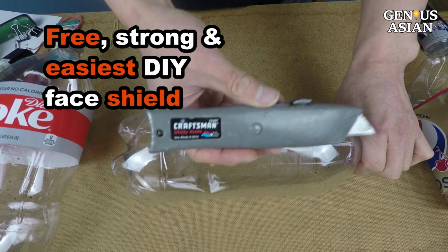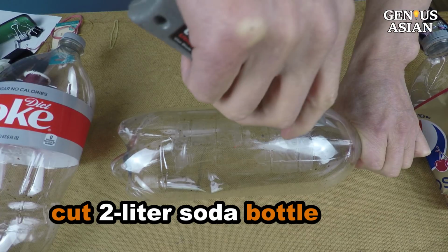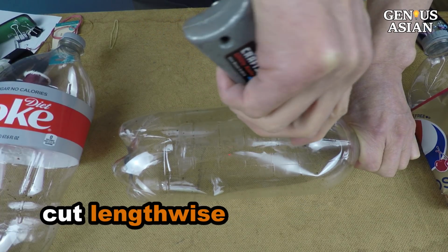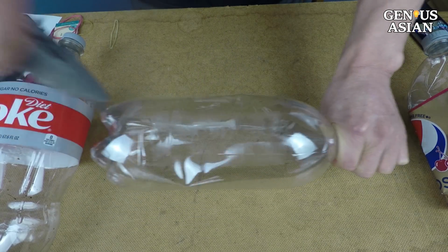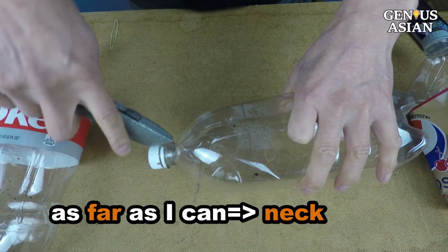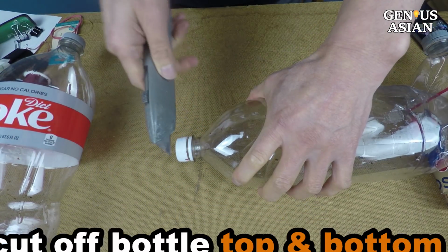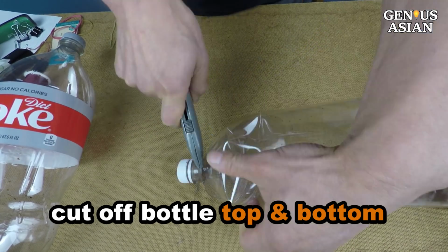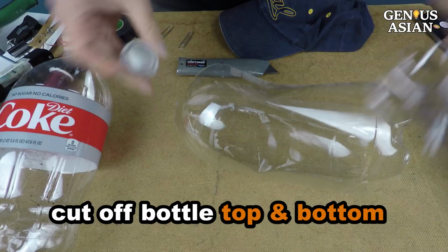Today, I'm going to show you how to DIY a couple of face shields. This is a 2-liter soda bottle. I start from here and cut lengthwise towards the bottom, and then up towards the bottle neck. I go as far as I can until I hit the thicker bottle neck. Then I cut off the bottle top and cut off the bottom.